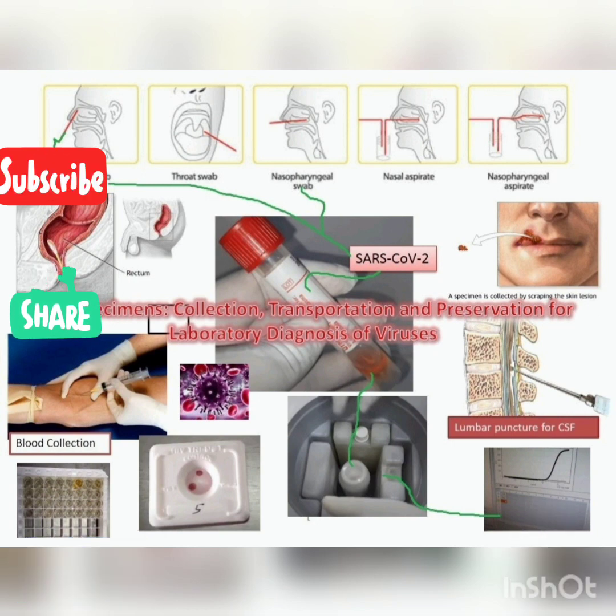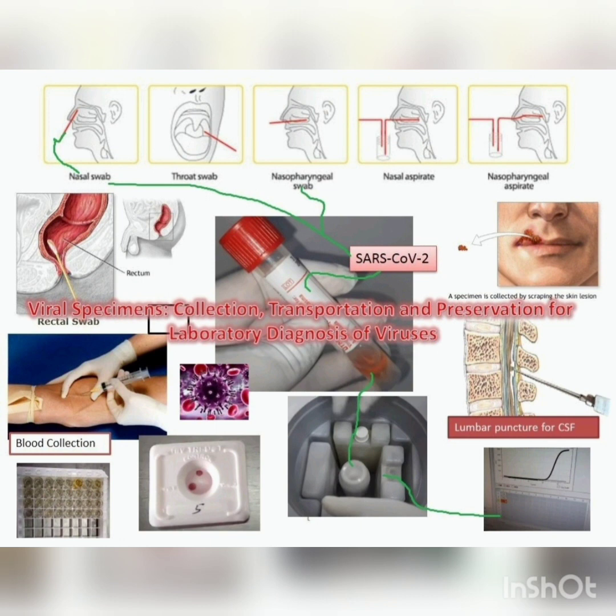In hospitals they collect a nasal swab, nasopharyngeal swab, oropharyngeal swab, or some specimen from the eyes, ears or throat, or gastric lavage, or they collect some specimen of cells, or pus, or sputum, or stool, or discharge from a wound. They send that specimen for investigation to the laboratory.